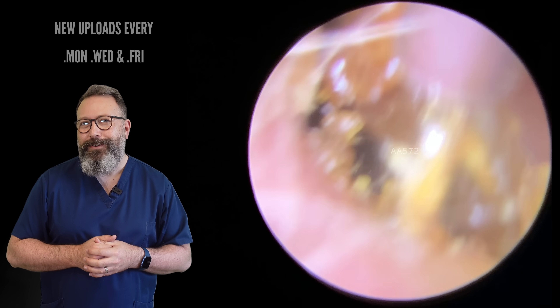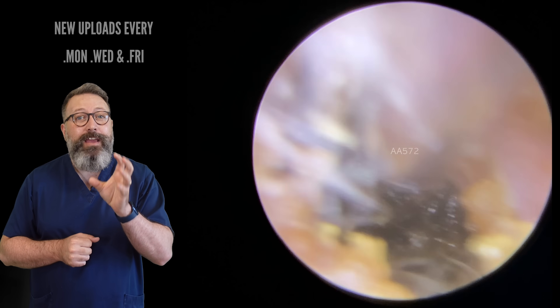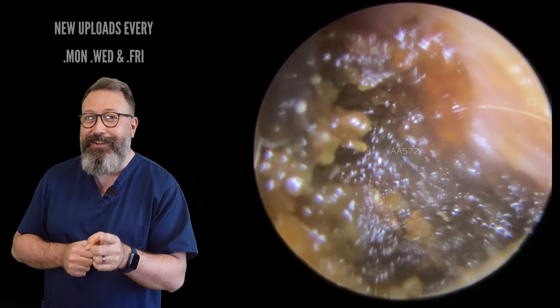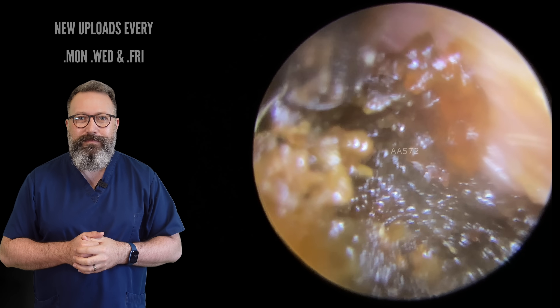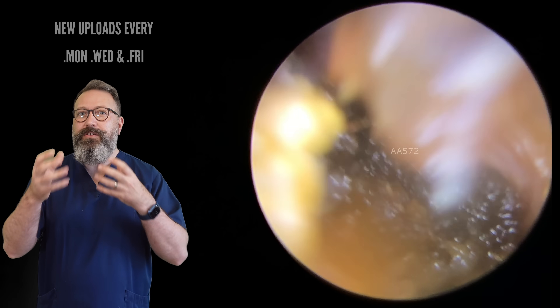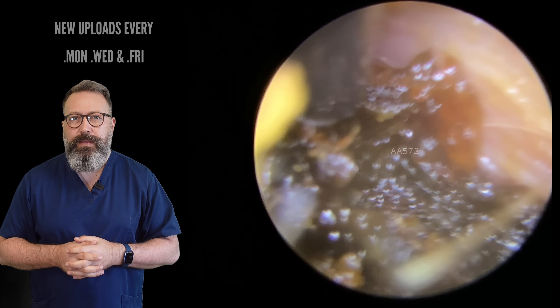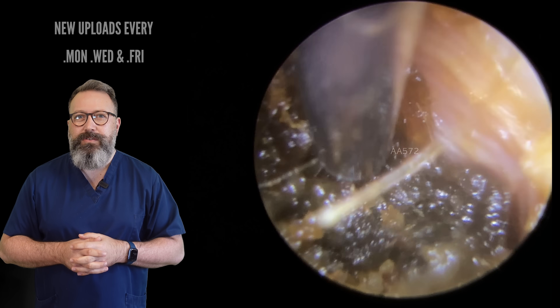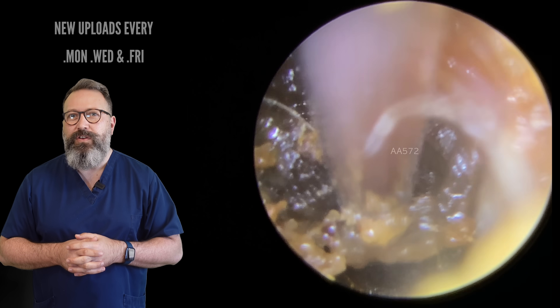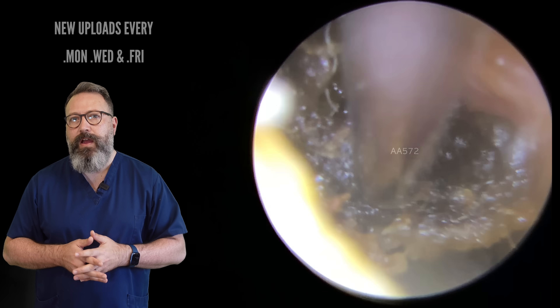Have you seen that foreign body yet? I've gone back over this video a couple of times and I can't see it — I'll be interested to hear when you guys spot it. Now we can see we've got that harder plug we were talking about. We've got rid of some of the looser bits on the outside edge and we've got that much harder plug deeper in the canal. Trying to work on the outside edge — it's a really difficult one to get hold of, as it's dried into that shape of the canal.